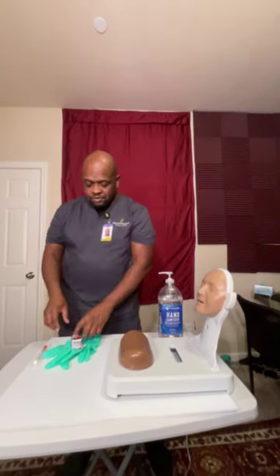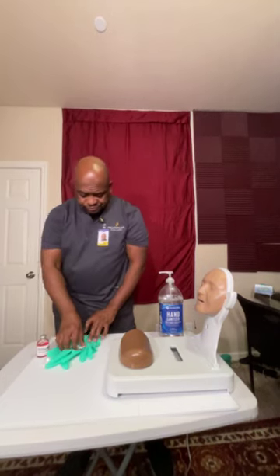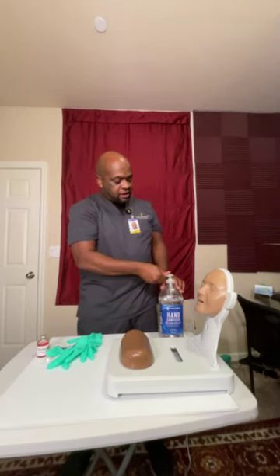Before I begin this skill, I should say I do have my ID on. I'm also wearing the school uniform. I have hand sanitizer here, so I'm going to go ahead and start by cleaning my hands.